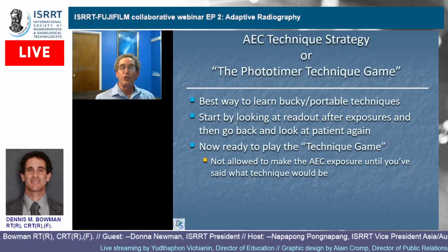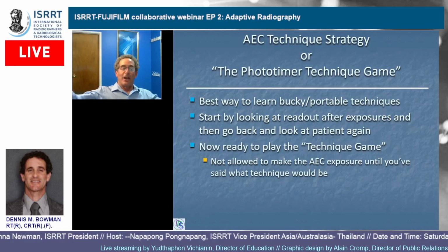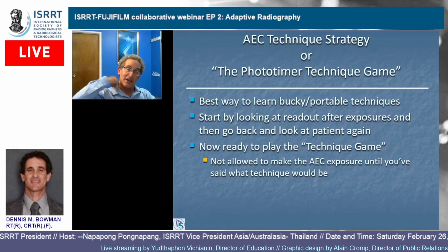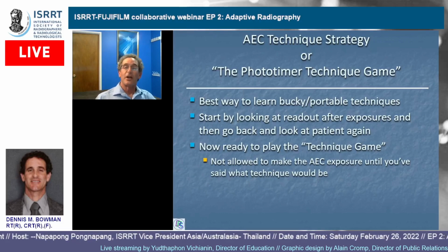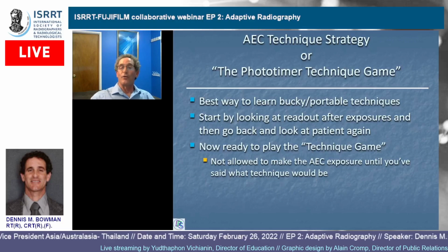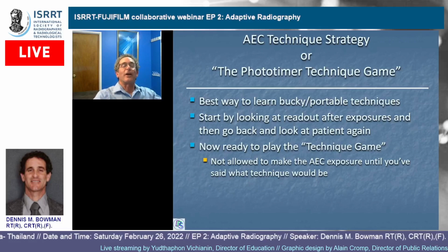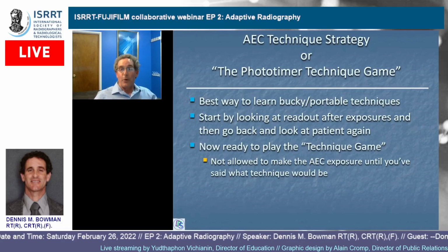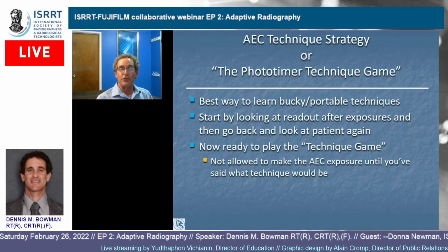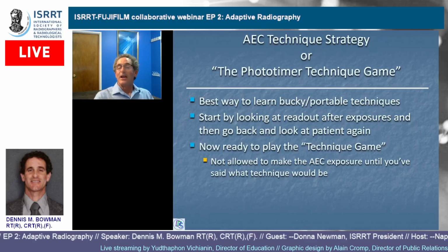And so then finally, when you do need a technique, or you're just going to look and go, man, I think I could technique better than the AEC. The AEC seems to always kind of go in the range, but it's more in the higher end of the range, and I want to be at the lower end of the range. So I can actually technique better than the AEC, in which case you should tell your boss, because that means you should have a field engineer come in and they can cut things in there and make it be that way. And you should, because then you're right. You are over radiating patients for no reason. But still, when you do portable work and go to the OR and the ER and you're just doing portable mobile work, you are going to feel so much more secure, because now you really are totally on your game when it comes to techniquing, even though you didn't technique.